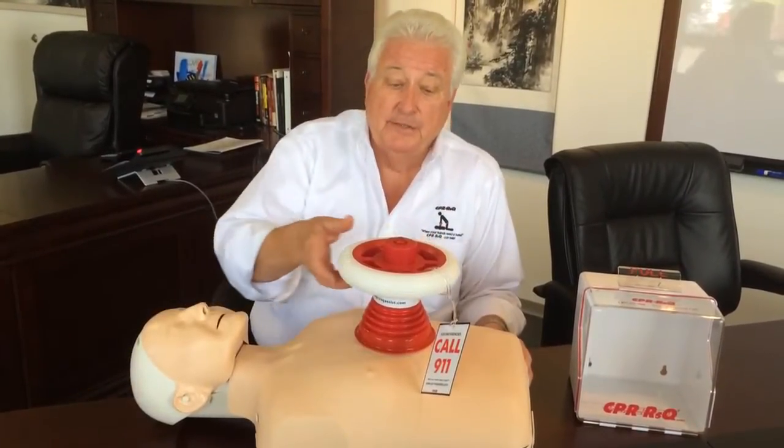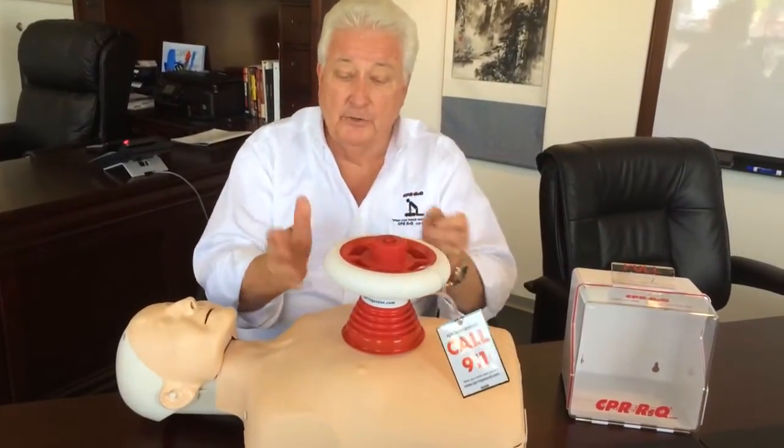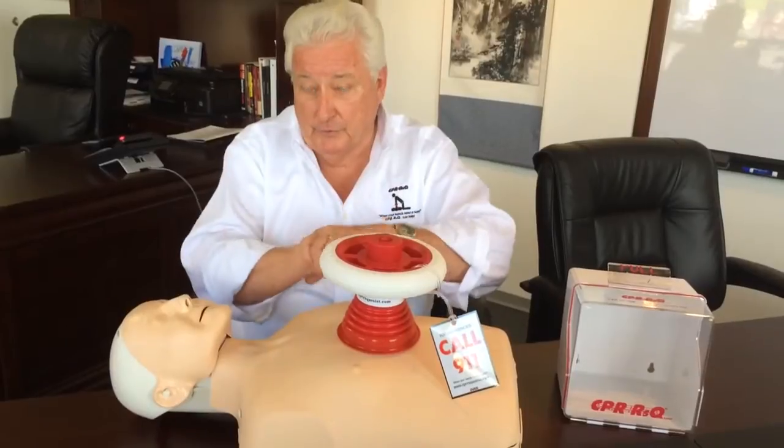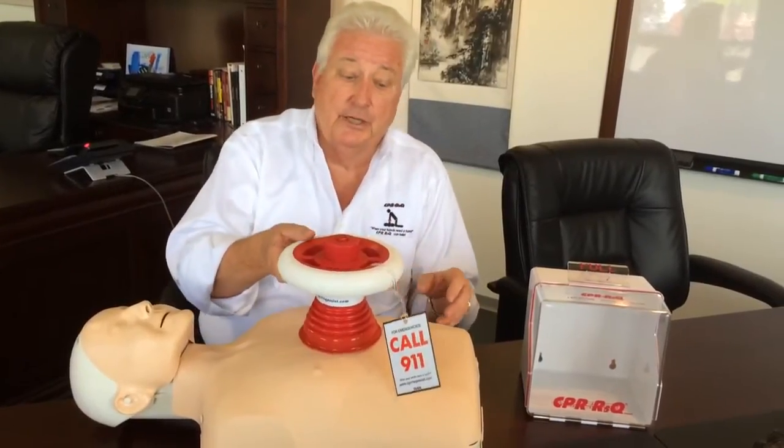I'm Joe Hanson, president of CPR Rescue Assist. The CPR Rescue Assist was designed to assist in the application of hands-only CPR. The base of the device is approximately four inches larger than the palm of your hand, which you would traditionally use during hands-only CPR. The advantage is it's a bit of a cushion on the victim's chest, and it also disperses the energy over a larger surface area on the victim's chest.